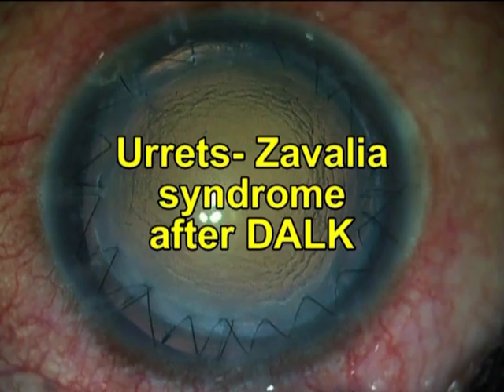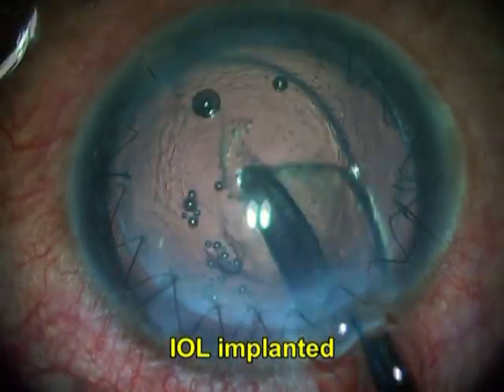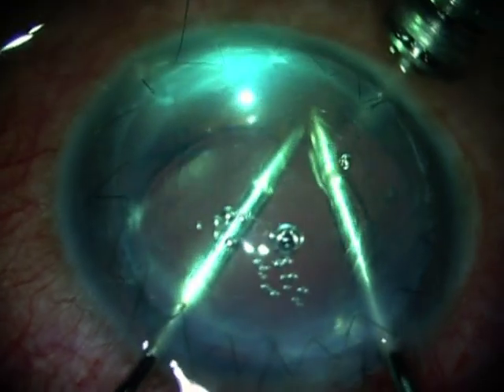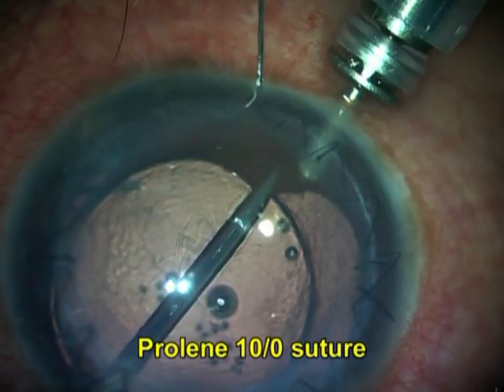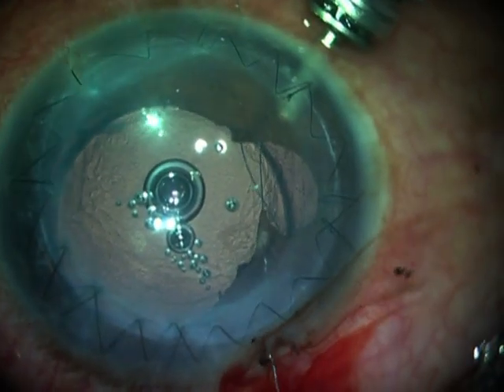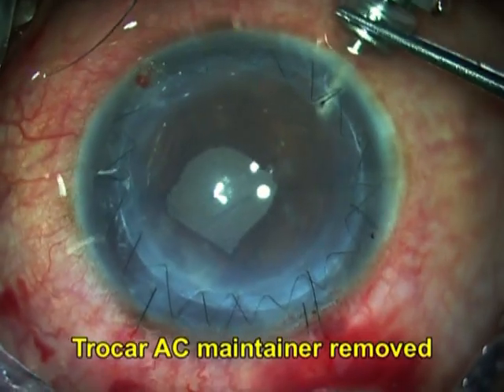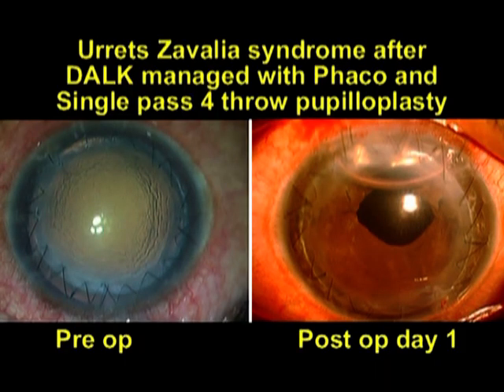Urrets Zavalia syndrome can occur after DALK, and if the eye is phakic one can make it pseudophakic and then perform the single-pass 4-throw pupilloplasty. In a case of Urrets Zavalia syndrome, prior to doing single-pass 4-throw pupilloplasty, pupillary stretching is performed at every clock hour, wherein the pupillary edge is pulled with an end-opening forceps with an aim to release the pre-existing peripheral anterior synechiae from all quadrants of the angle. Once the iris has been released and is comparatively mobile, pupilloplasty can be performed.